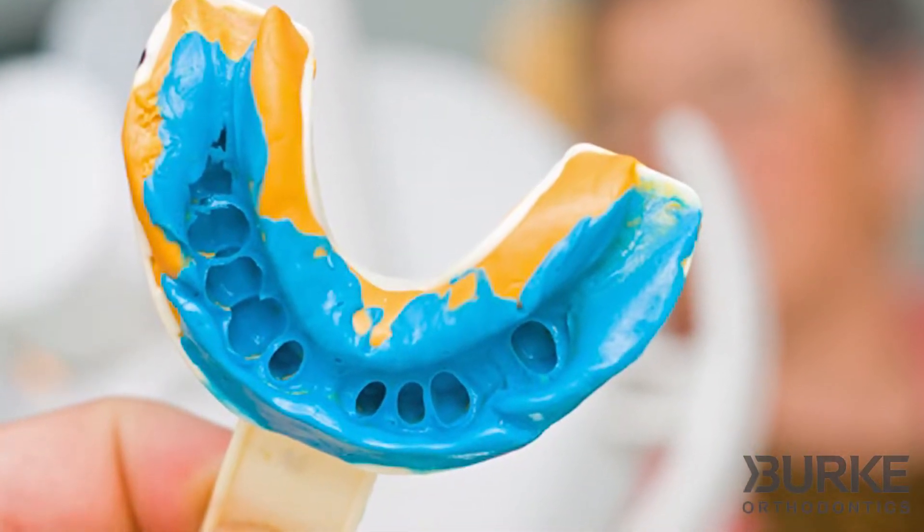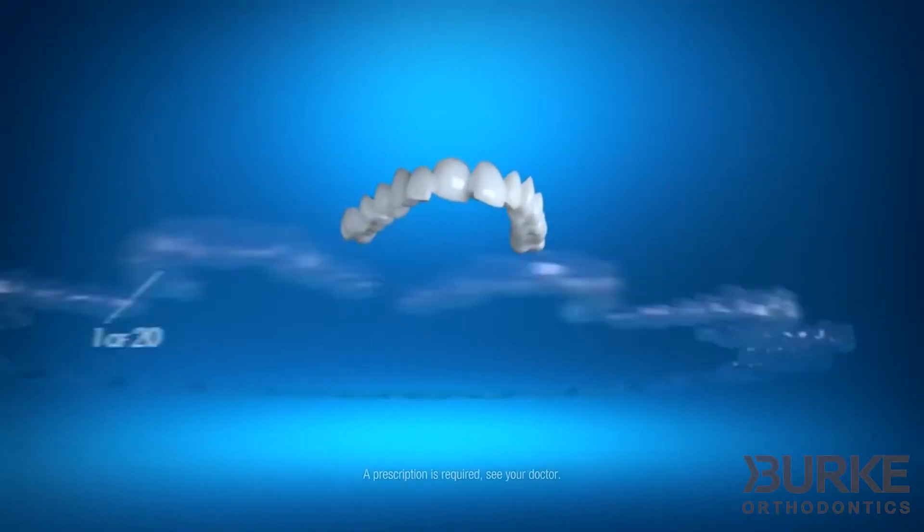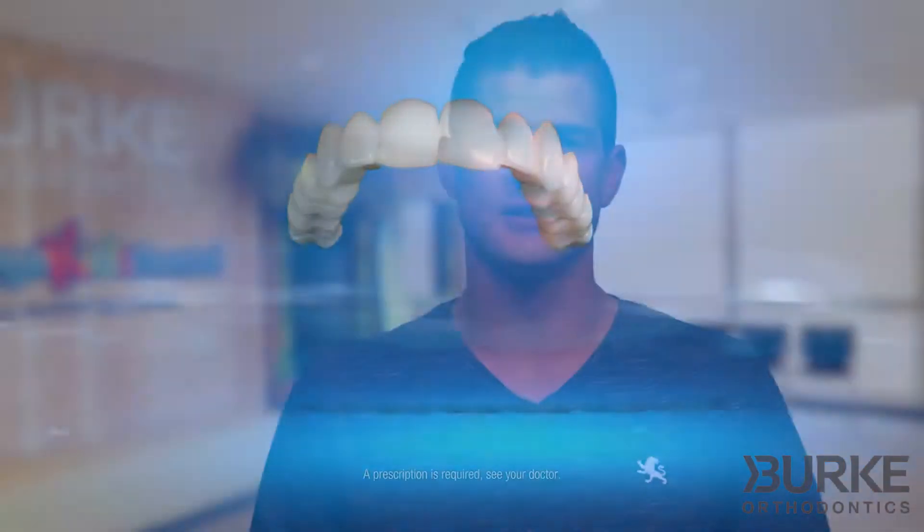An impression of the teeth is a necessary and very important part of orthodontics. An impression is used to make a model, and a model is then used to make whatever your orthodontist needs — whether to straighten your teeth, such as Invisalign, or retain your teeth, such as a retainer.